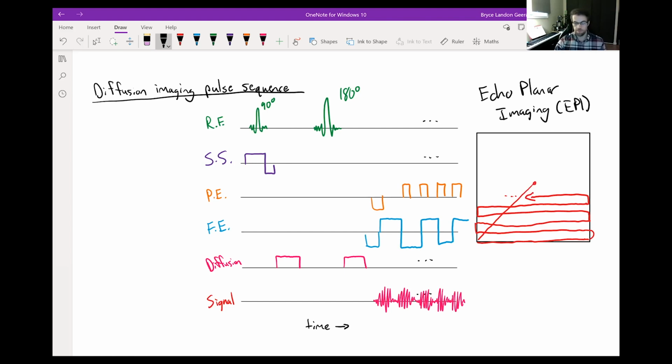There's a few more technical reasons that I'm not going to go into here that have to do with chemical shift and differences in phase due to the air cavities in your head. So there are other concerns about acquiring multiple lines of K-space, but essentially the quicker you do it, the more signal is available, and that's where we're going to leave it for now.